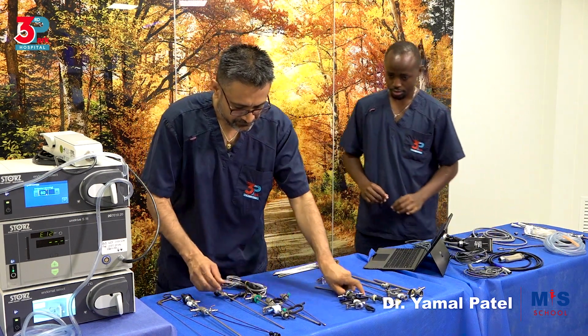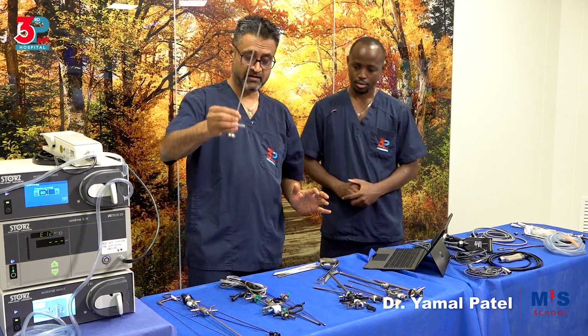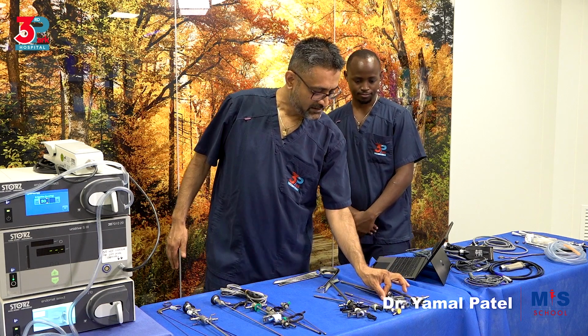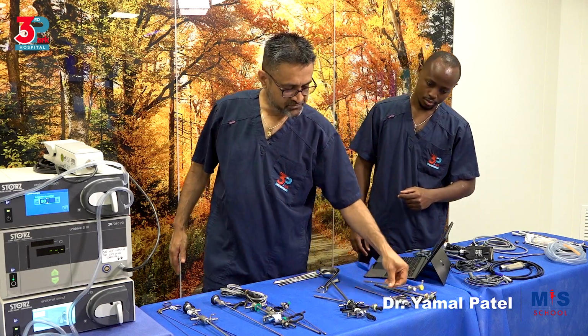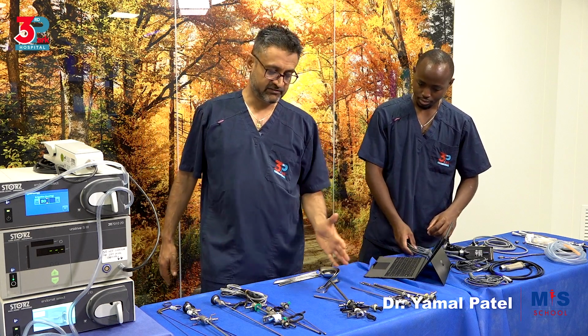So we have the cables that are used. This is a resectoscope along with a telescope. Same here: working element, inner sheath, outer sheath, obturators, cables, and a telescope.